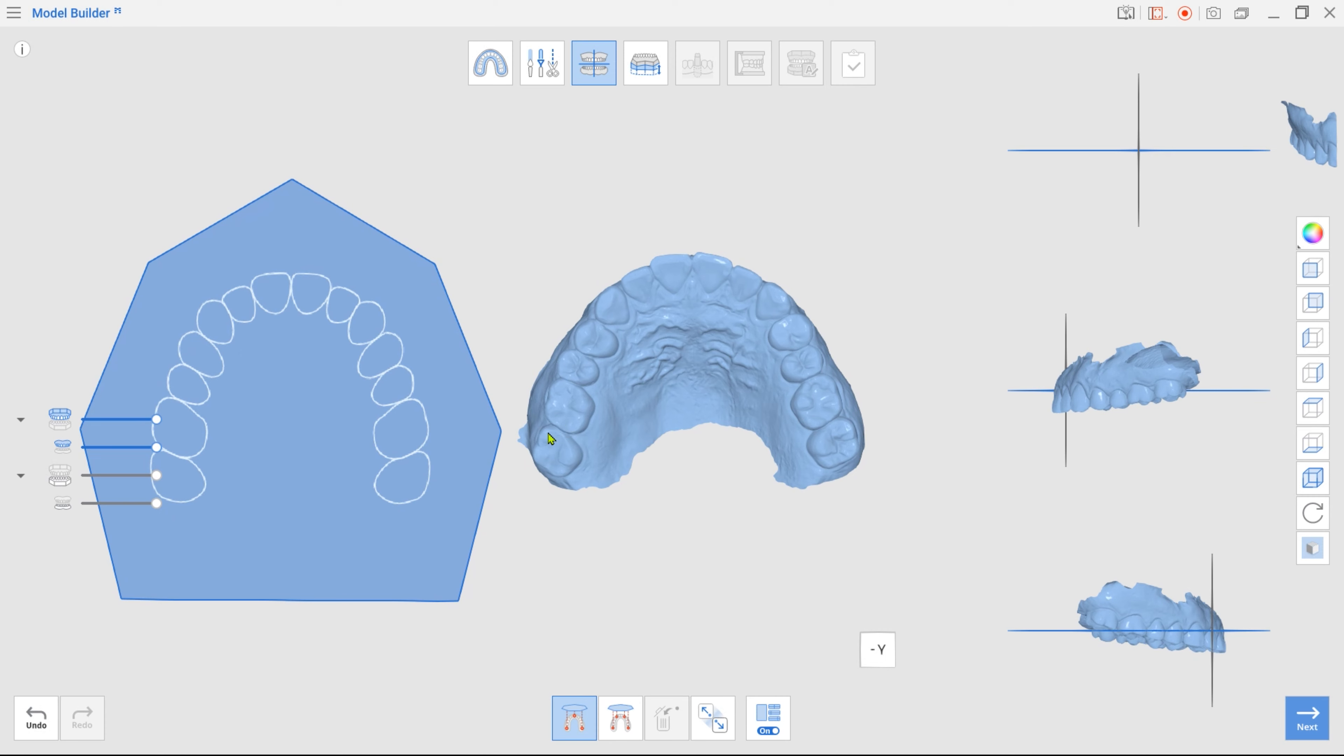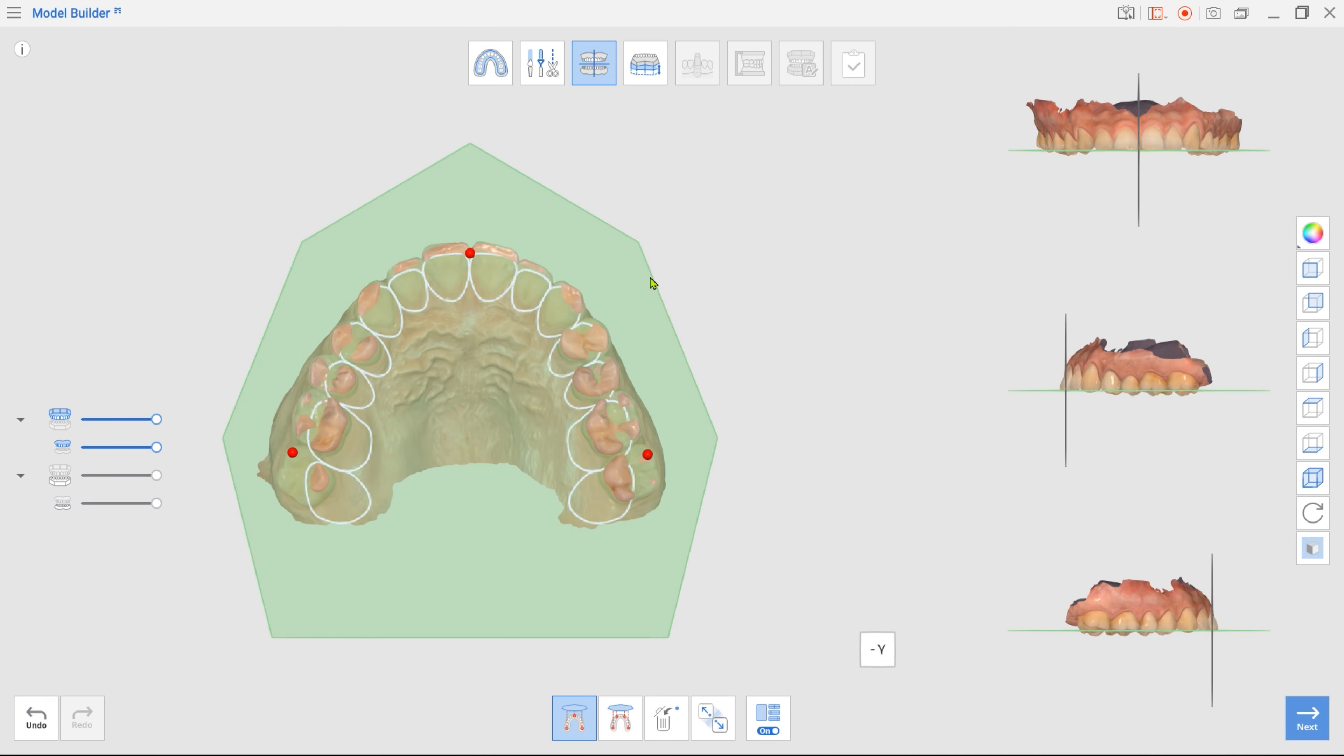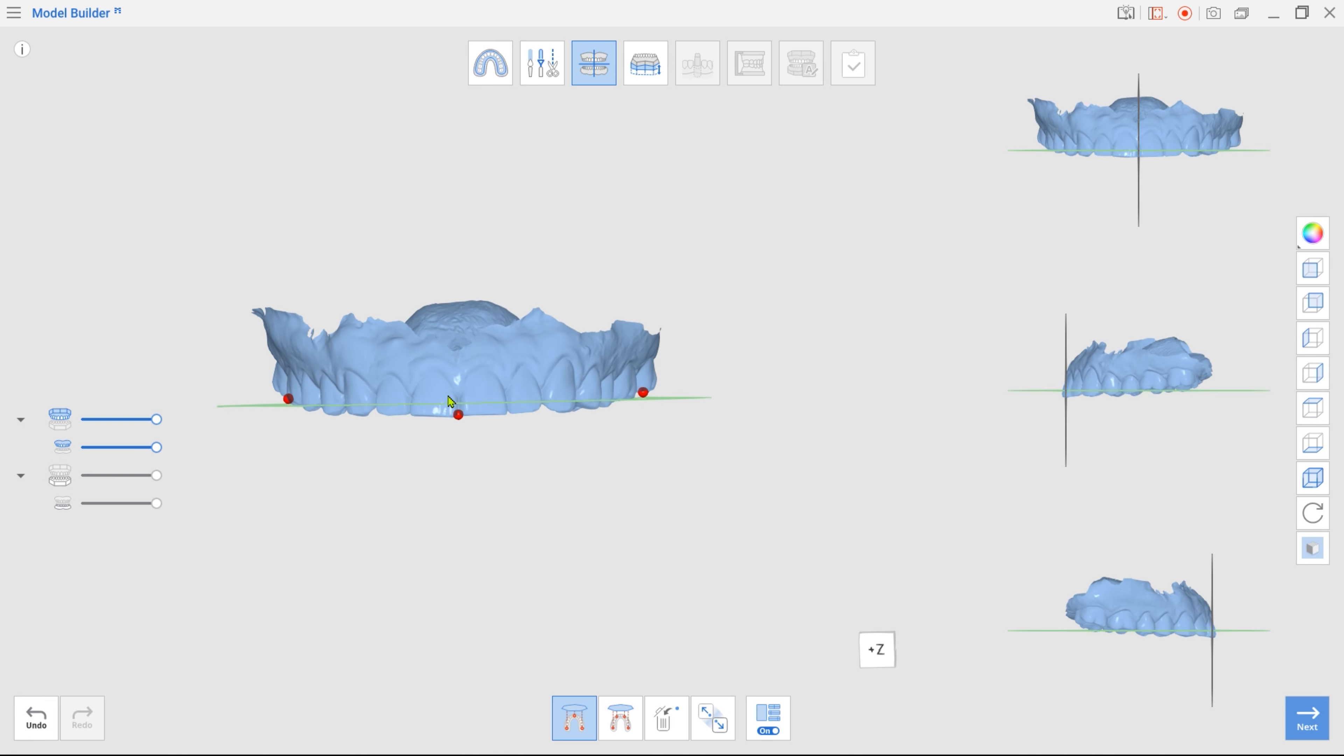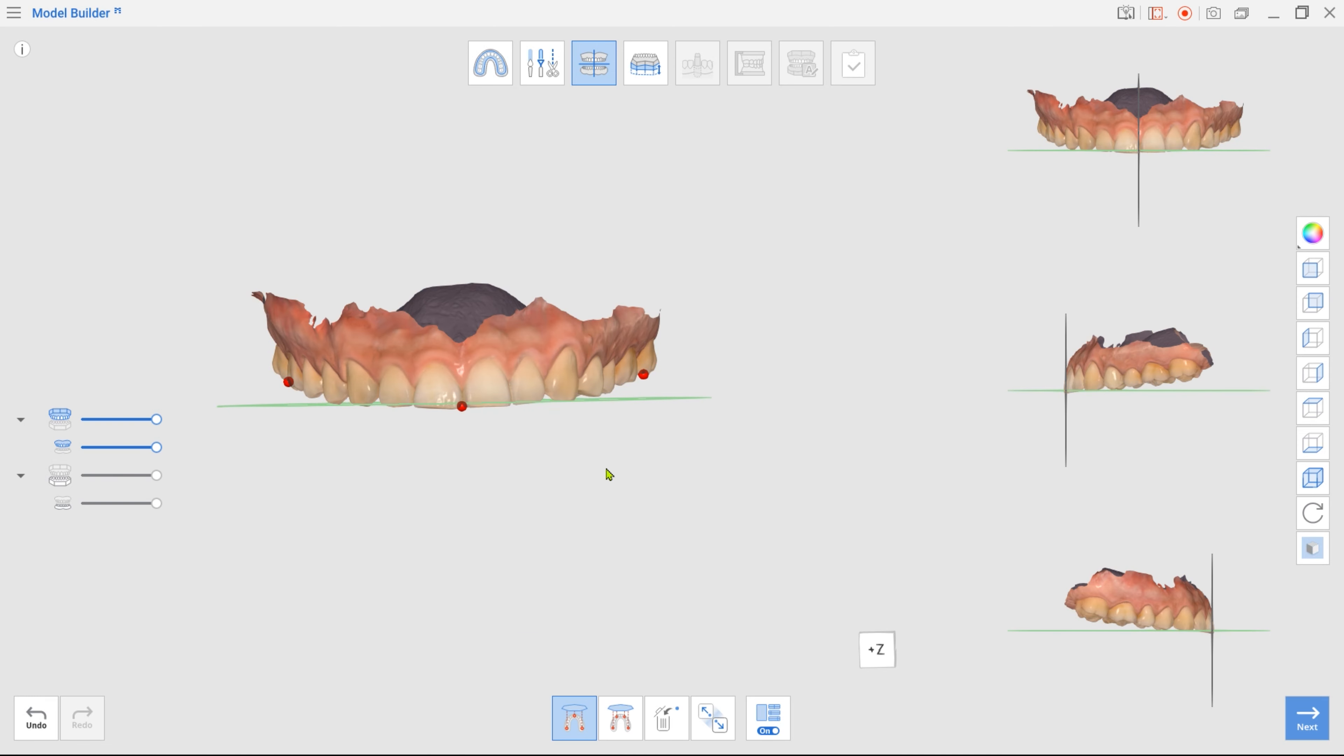Select three points on the data as shown in the video to align the data with the virtual occlusal plane. Ensure the data is properly positioned by reviewing it from all angles in multi-view.